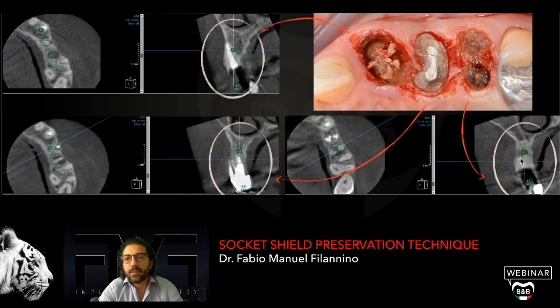The second premolar, the 25, has a very huge diameter in the palatal-buccal dimension, but still a little bit of apical bone that we can use, where I could use osteotome techniques to perform a little crestal sinus lift. So I did like Dennis Tarnov says, one miracle at a time.